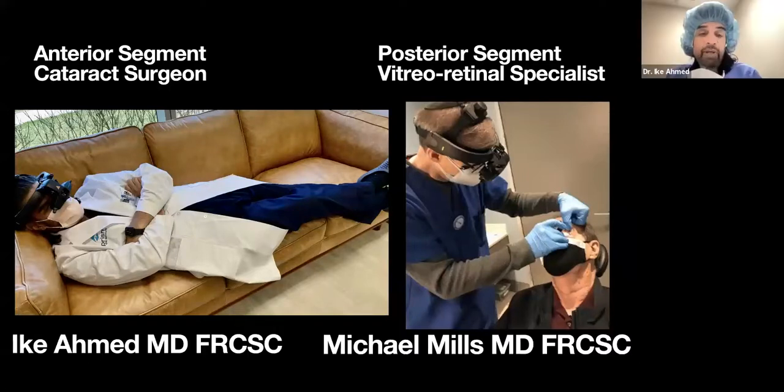Yeah, I think that's an interesting point. I was interested in reading that, although most diabetic eye disease presents in the posterior pole, and a slit lamp lens will typically give you that, there are a subset of patients who may present more commonly beyond the arcades in the peripheral retina. And so it does seem like that would be the standard of care. So that's something perhaps we can get the audience to consider.